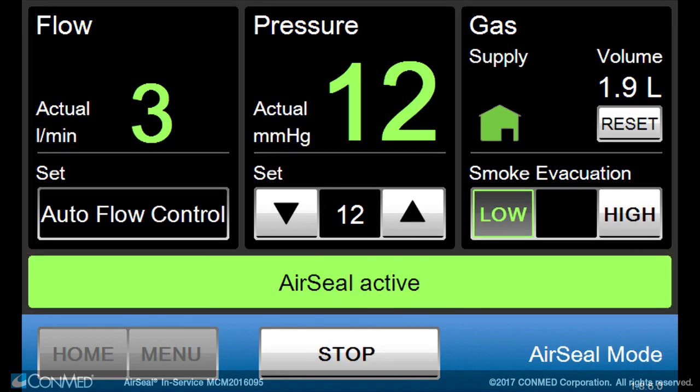Once air seal mode is active, the flow rate is set to auto flow control and the smoke evacuation can be set to either low at 3 liters per minute or high at 8 liters per minute.